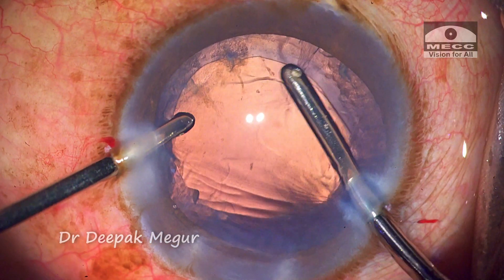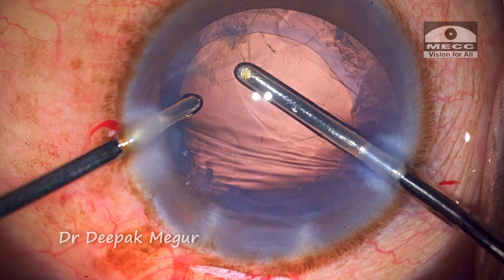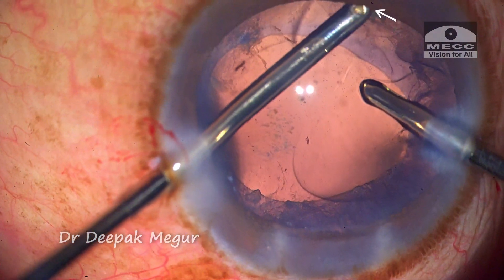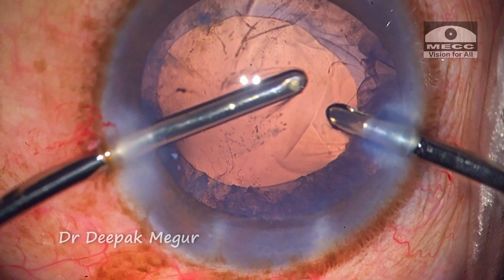To aspirate the cortex, the aspiration probe engages the cortex and is then moved horizontally in a tangential plane to maneuver the trapped cortex from under the CTR and out of the bag. This technique of tangential cortex stripping is beneficial in such situations.